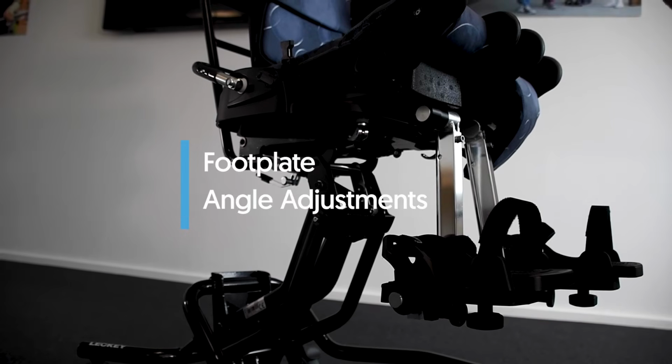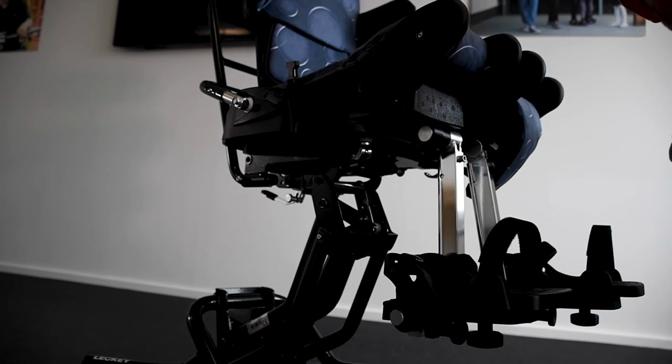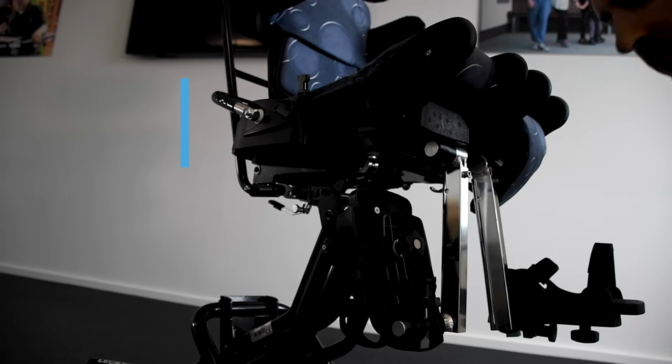Footplate angle adjustment. To set the angle to accommodate plantar flexion or dorsiflexion, simply loosen or tighten the hand knob to select the angle you require. The footplates can simply flip up to transfer.